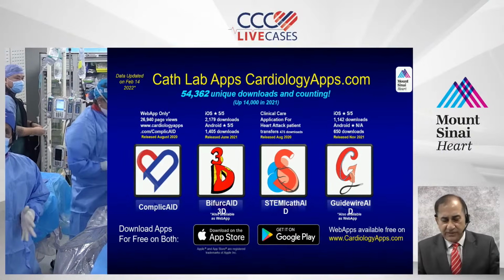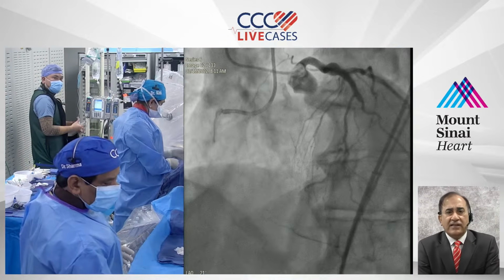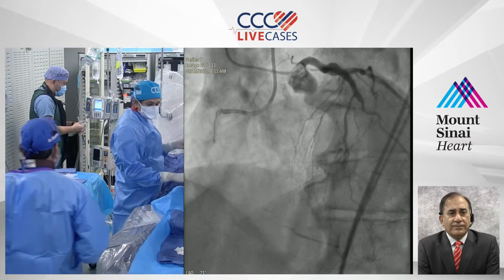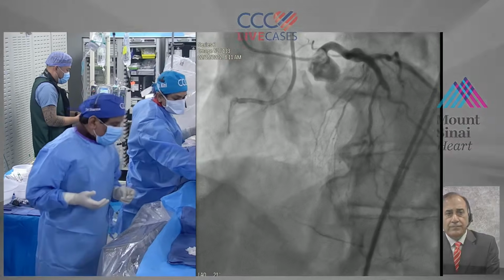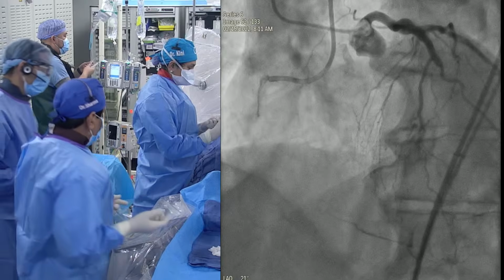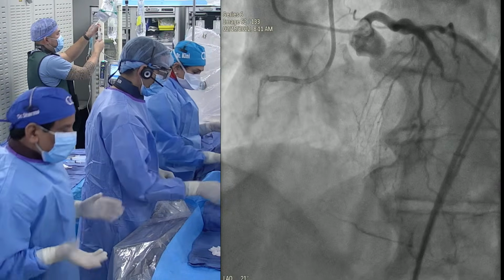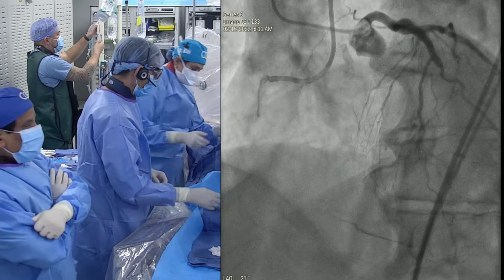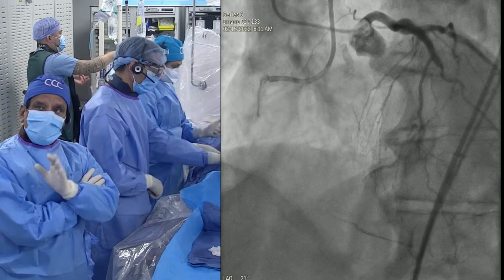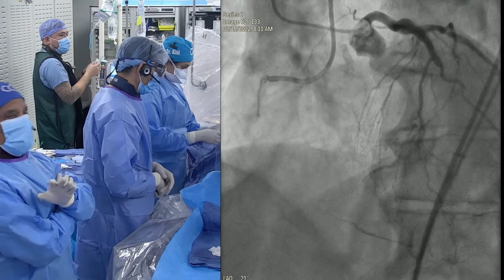The first question has come. Could you tell them, would you attempt this with wrist access? I think at least contralateral. The people who are expert with the radial will do this case with bilateral wrist. But remember, we showed the data that in the registry, bilateral wrist for CTO is used in maybe 7-8% of cases.